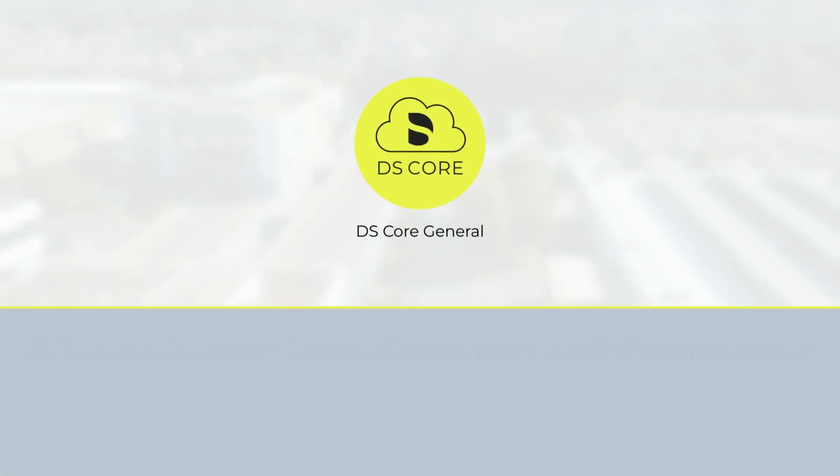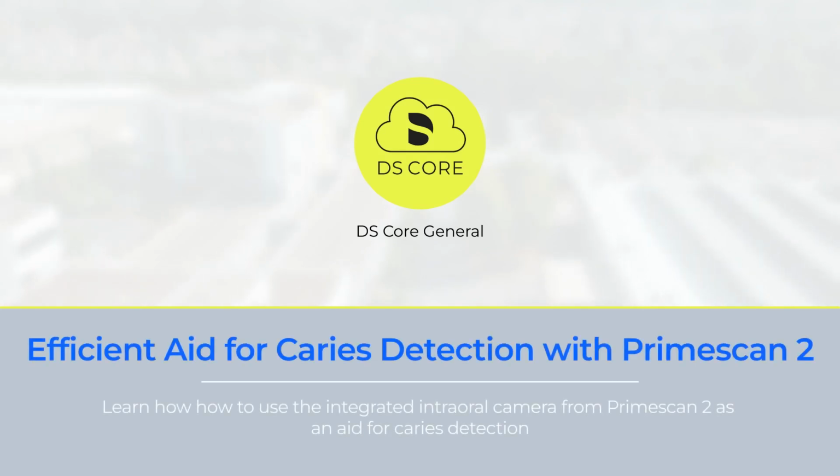In this tutorial, you will learn how to use the integrated intraoral camera from Primescan 2 as an aid for caries detection.